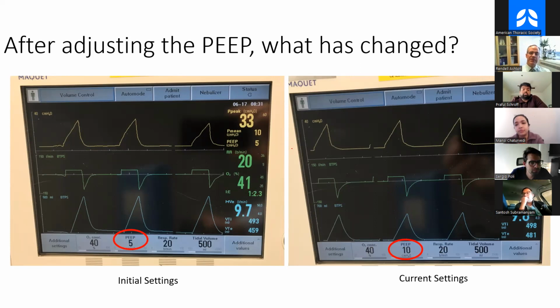So let me show you something real quick here. Remember going back to our waveforms, here's the square waveform of flow. If you can hallucinate with me, can you see a little jump in the pressure right there before it starts to go? If you can see it better here, maybe. It goes straight up and then it goes up at an angle and then it drops down at the end of the breath. What's this little straight up part?